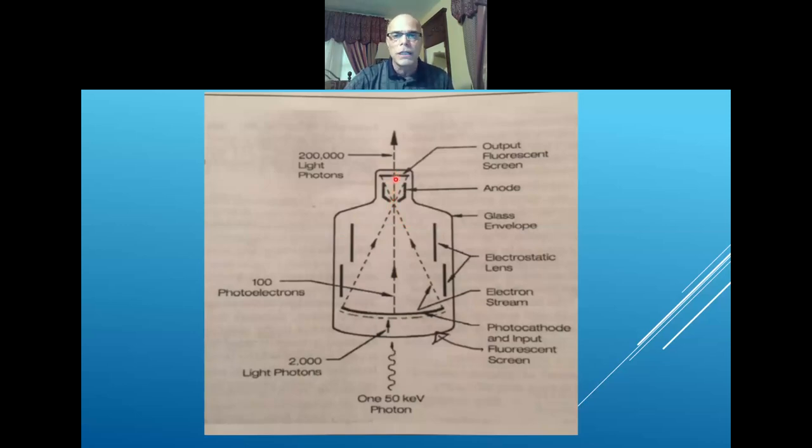It's fluorescent also. You had 100 electrons going through this tiny, tiny little output. But what they've picked up is kinetic energy. These things, I think I will get into like 5 to 10,000 or something like that. But up here, you got like 25,000 volts applied to the anode. So there's a huge pull for these electrons. So they're picking up the speed, just like in your X-ray tube. So that speed is going to allow them, when they interact with this fluorescent screen, they have so much more. We've got 100 electrons, but they got substantial kinetic energy.